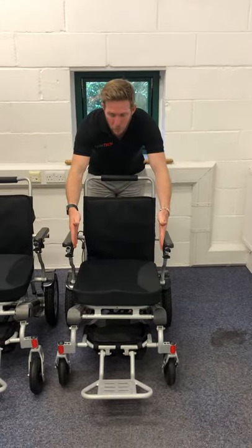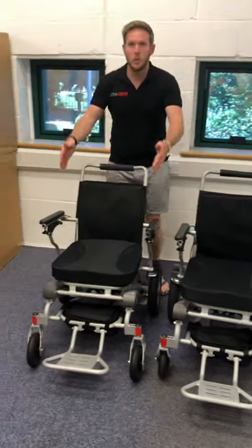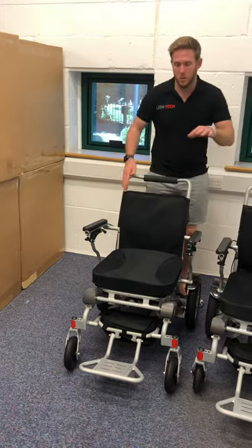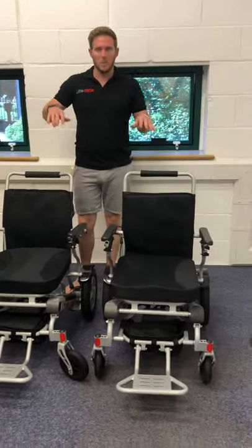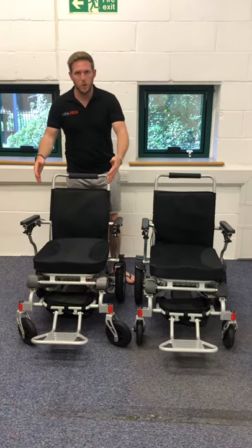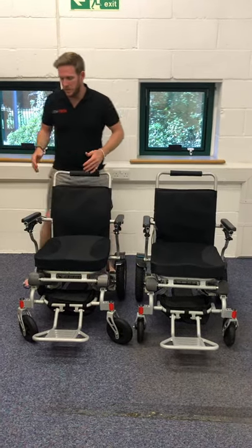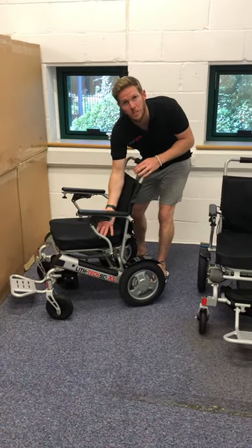On the normal Smart Chair you've got 48 centimetres between the armrests. On the XL you've got 53 — I do apologise. So this would certainly suit the larger individual. They both take up to 160 kilograms, but obviously it's the space between the armrests that really makes the difference, because it's this crossbar when you're sitting in it that can dig into people's hips and thighs.